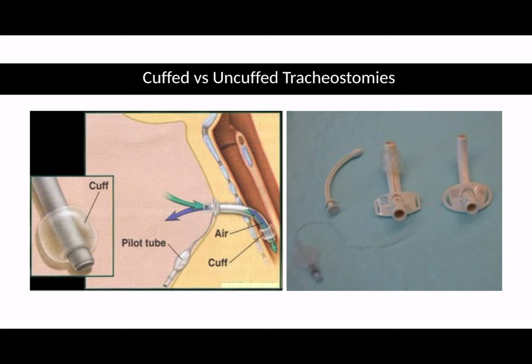If you've got a large tracheostomy, for example a size 9, and if you remember back from my last talk, the numbers are analogous to that of an endotracheal tube. So a size 9 tracheostomy denotes the internal diameter in millimeters of the tube. So a size 9 tube has a 9 millimeter internal diameter. So it's quite large, will cover a lot of the trachea, and therefore when you bring down the cuff, you might find that there's not a lot of room around that tracheostomy.